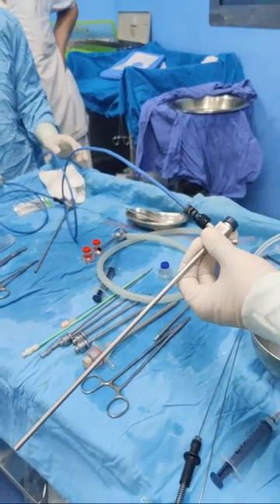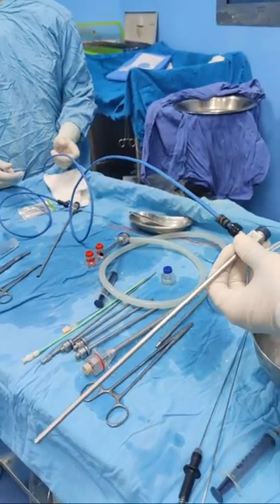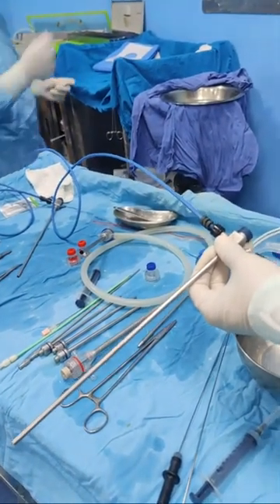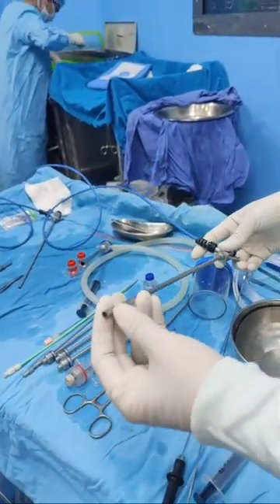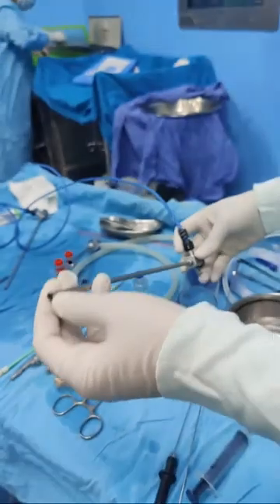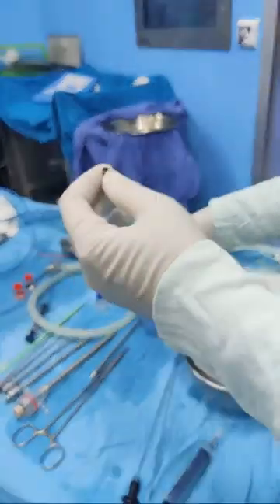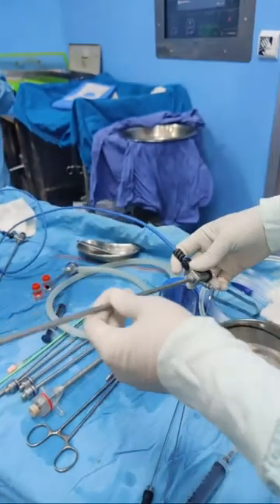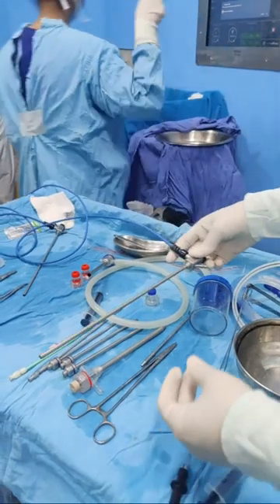Bring the pneumatic probe. So the pneumatic probe of 1.8 mm also goes in here. We have selected a staghorn stone, and in a staghorn stone we'll use the 1.8 mm pneumatic probe, and that will break the stone very easily. Is this clear?